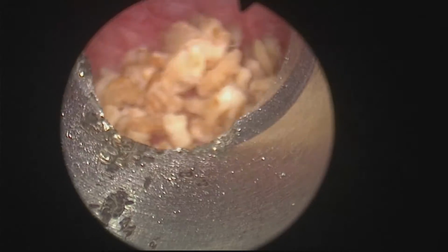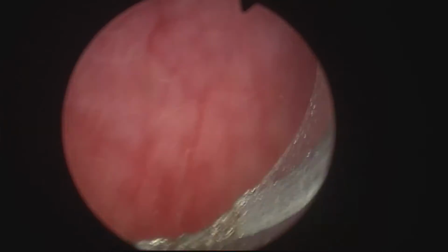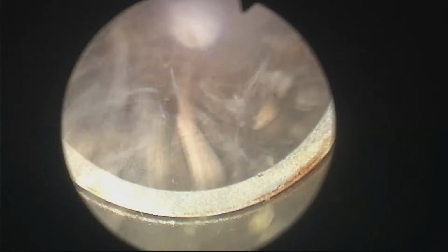There you are. So this was the fragmented stone, most fragments still in the diverticulum. So I like to evacuate fragments by gravity. I fill the bladder, I point to the stones, I close the inflow, and then I take out the internal sheath, you see. So the stones tend to be sucked or pushed out by the water coming out of the diverticulum or coming out of the bladder. Some of the stones went into the bladder, but again, I leave some time to fill the bladder, and then I like to take them out with gravity this way.